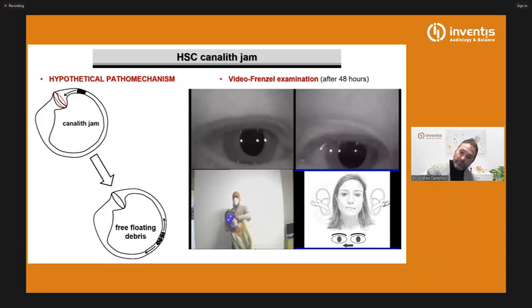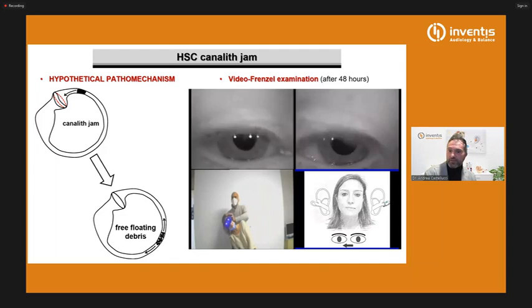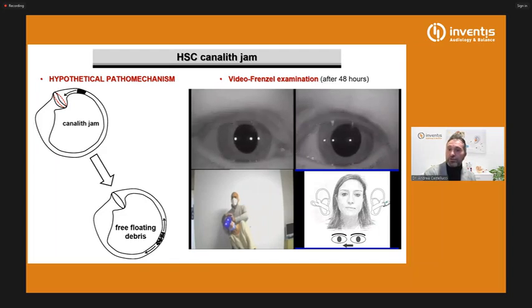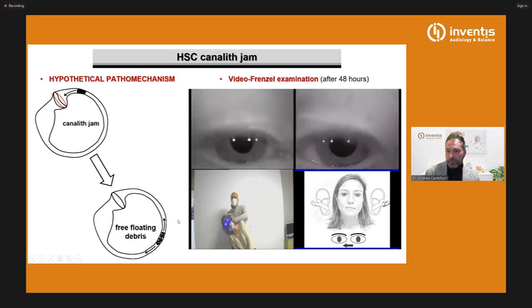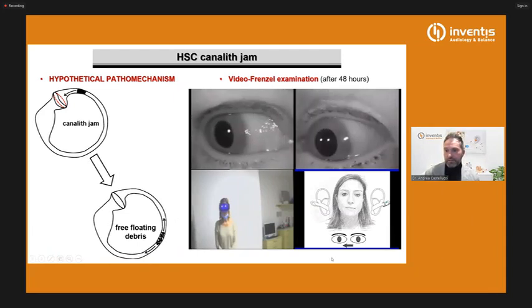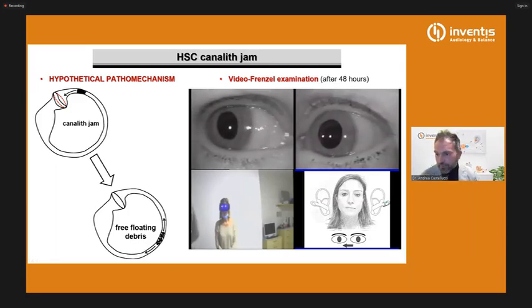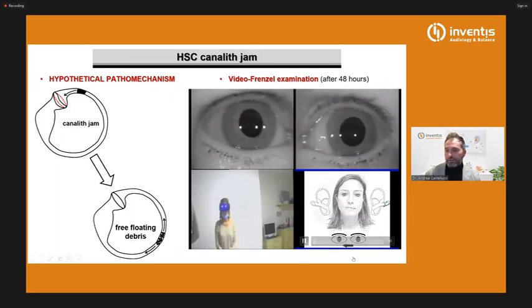And again, on the right side, there's a geotropic nystagmus. At the upright headroll test, there's a geotropic nystagmus. I'm sorry that it didn't start here. We can try again, wait. Let's see if it is more clear even with this tiny animation here.